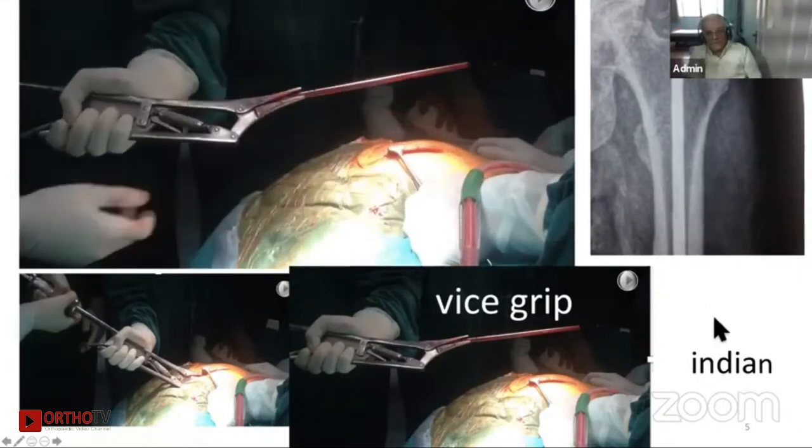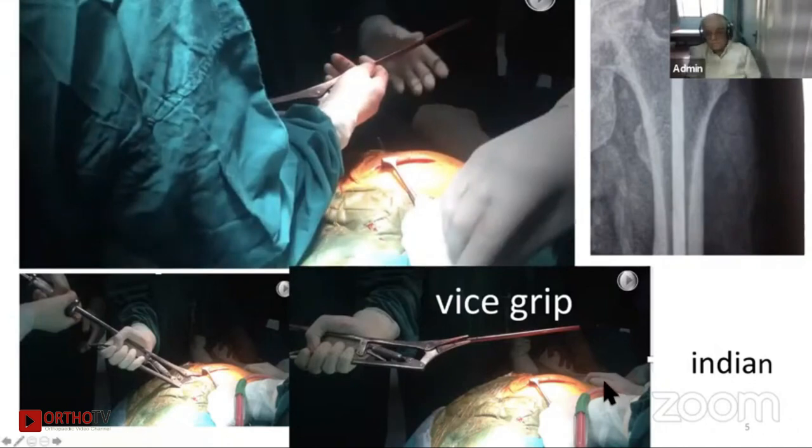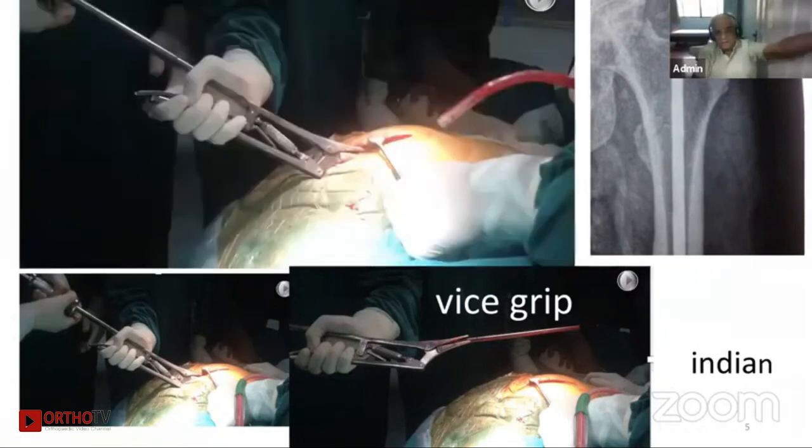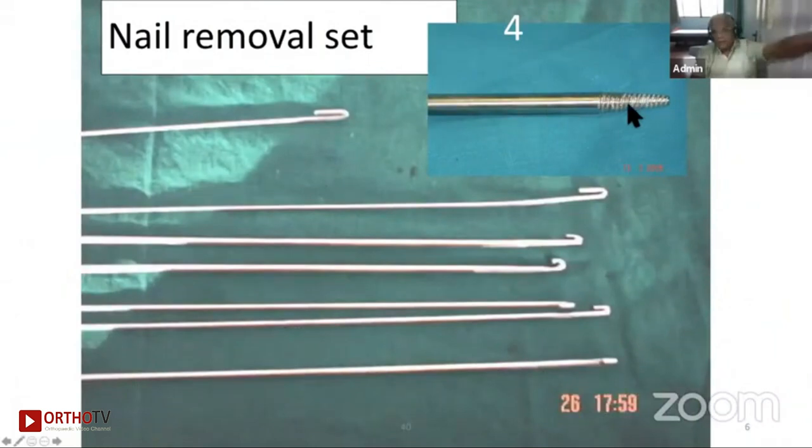I find so many occasions I have been able to use this very well. And this is the one which, again, almost everywhere where I work, I have got it there. And this is the nail remover. We all know very well that this is the one which Dr. Shiva started off, and it works very well.